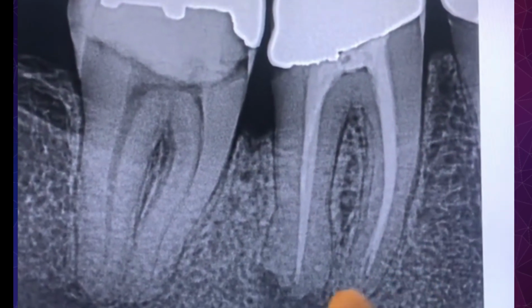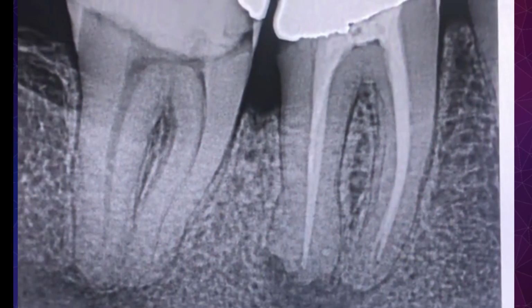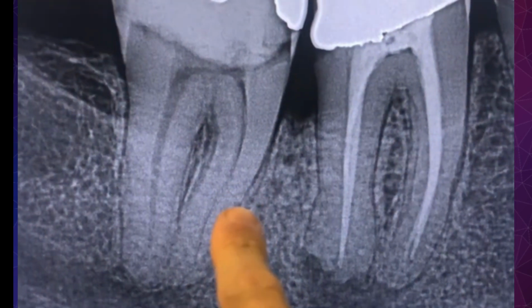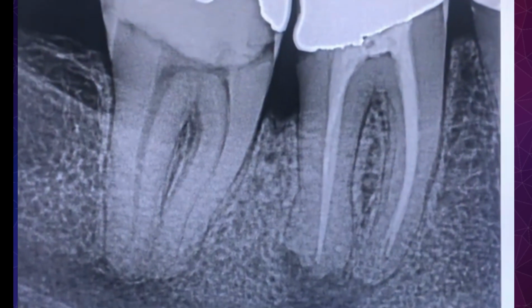Tooth number 30 RCT was done a few years ago, and you can see a periapical lucency associated with that tooth also. So we discussed options with the patient, and the patient wanted to try to save the tooth. So today we worked on tooth number 31. He'll come back so we can redo the root canal on tooth number 30.